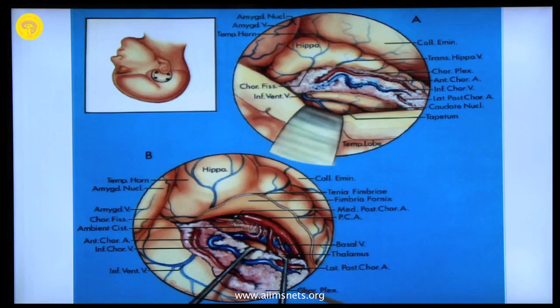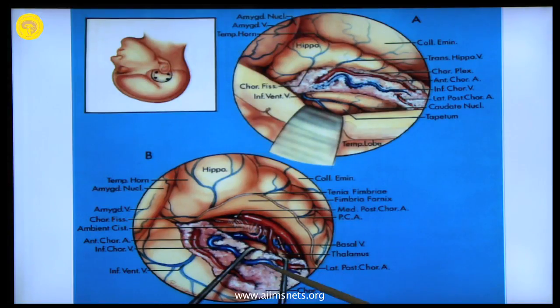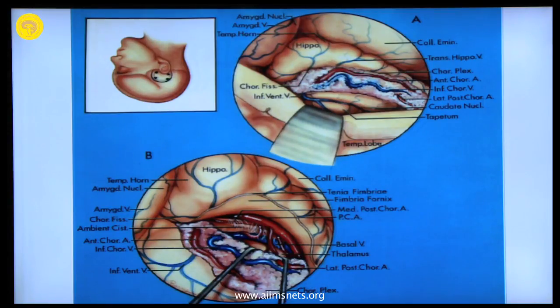This is your medial limit. You have to open the arachnoid there and then try to enucleate the hippocampus from all sites. If you breach this arachnoid, you see these vessels. The idea is to know these vessels are there and not breach the arachnoid while doing it — but this is only for people who are doing epilepsy surgery or operating on tumours in the medial temporal lobe.